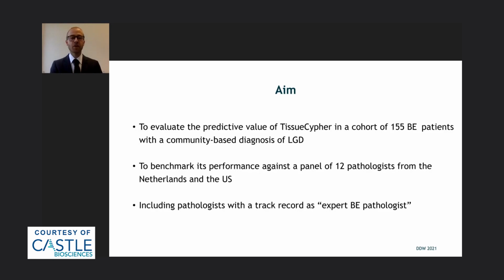So the aim of the current study was to evaluate the predictive value of TissueCypher in a cohort of 155 Barrett's patients with a community-based diagnosis of LGD. And second, to benchmark its performance against a panel of 12 pathologists from the Netherlands and the US, including pathologists with a track record as expert Barrett's pathologists.